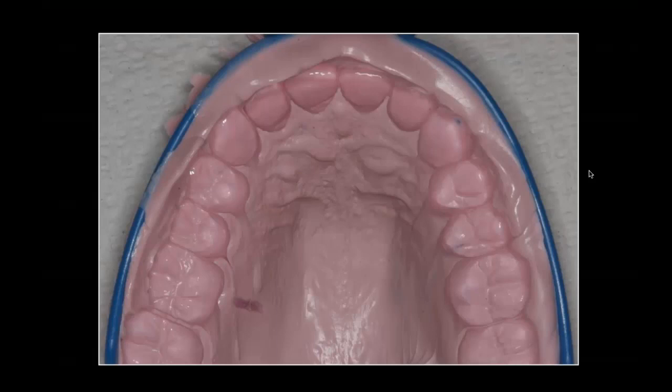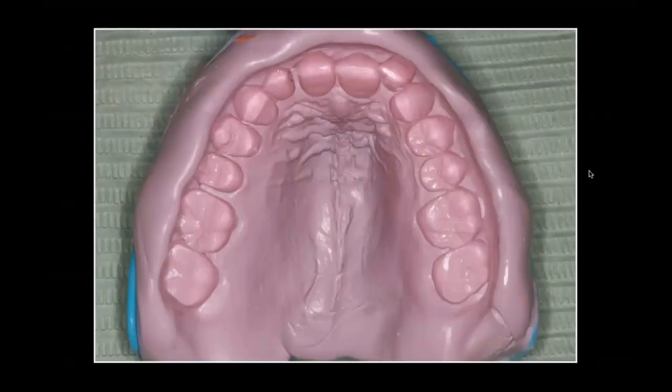And this is one of my typical preliminary impressions. When the question came in prior to our webinar and I looked at it, I went back, and I will tell you that I think the problem is in getting a drag off that second molar, and the rep recommended waiting 10 seconds. It has to do with the surface contact. It also has to do with the way you seat that tray.